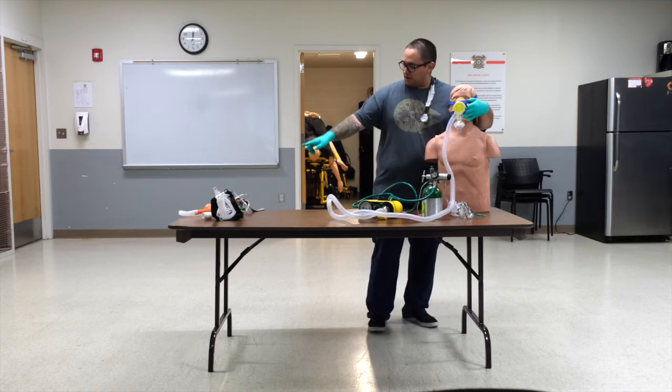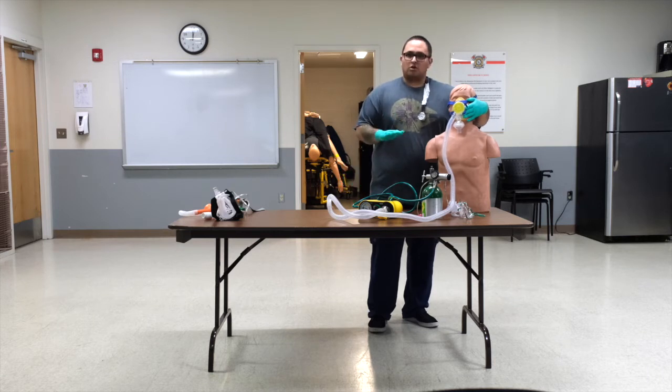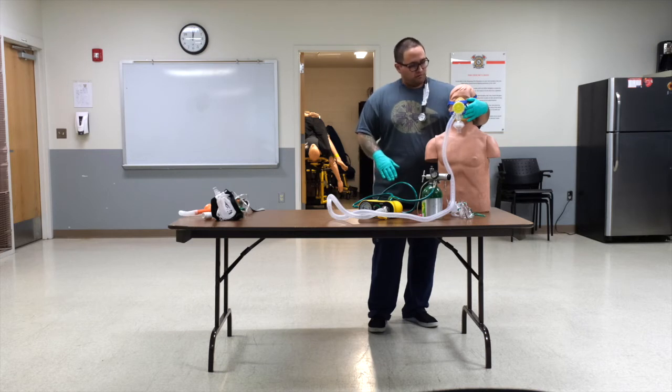For the Pulmodyne right here, usually goes in increments of 5, 7.5, and then 10 PEEP. So we can start kind of judging that as we go. Each time that we up the pressure for the patient, we need to make sure that we are reassessing all our vitals, reassessing our lung sounds, capno, SpO2.